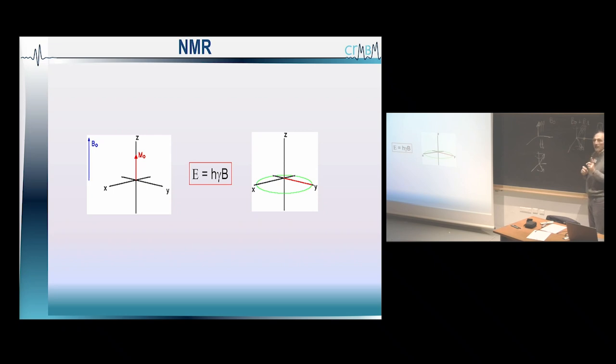This is not true. Why? Because these protons are part of different molecules. I'm talking about water, so very simple in here. The proton in the water molecule is in here. But we are talking also about fat, okay? Fat is completely different. Fat is this, a lot of carbon and proton.